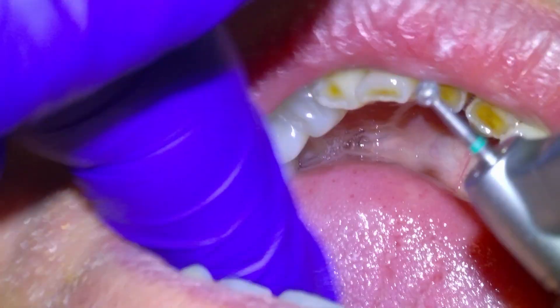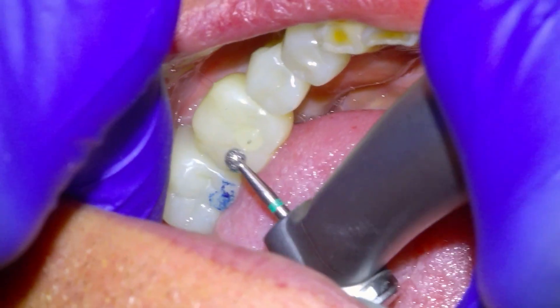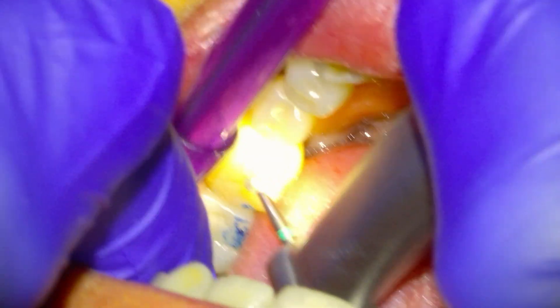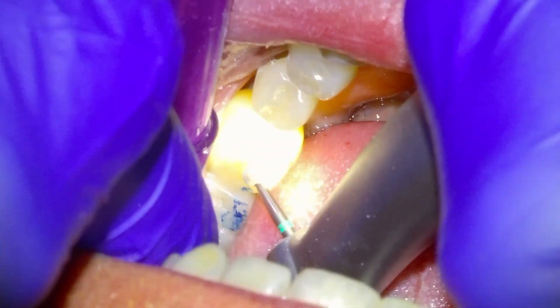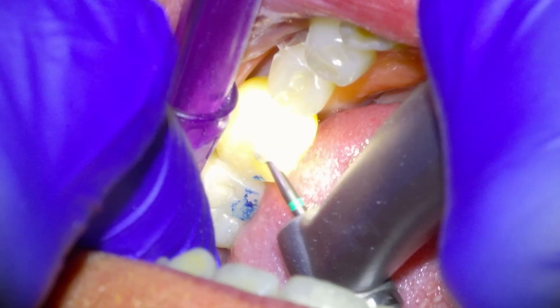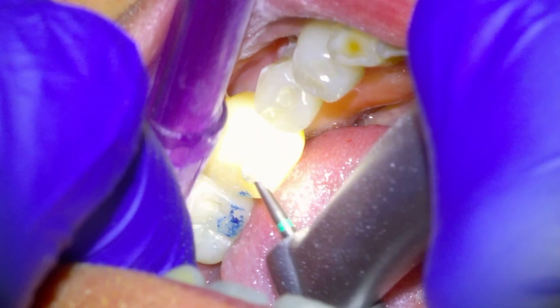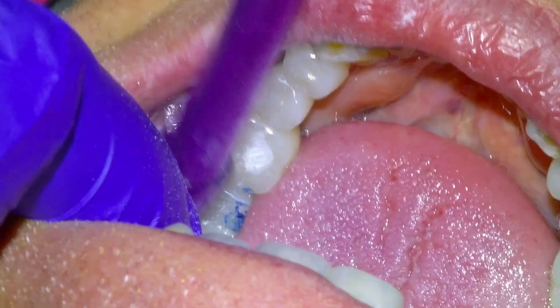Oh, there's a little high spot we're going to have to take down for sure. There's a little button. You would have felt that actually. I can see the mark on it where you bit down - a little dimple. So this would be like the final bite. Give that a bite and see if you can live with that or if it needs to come down. All done. Cool.